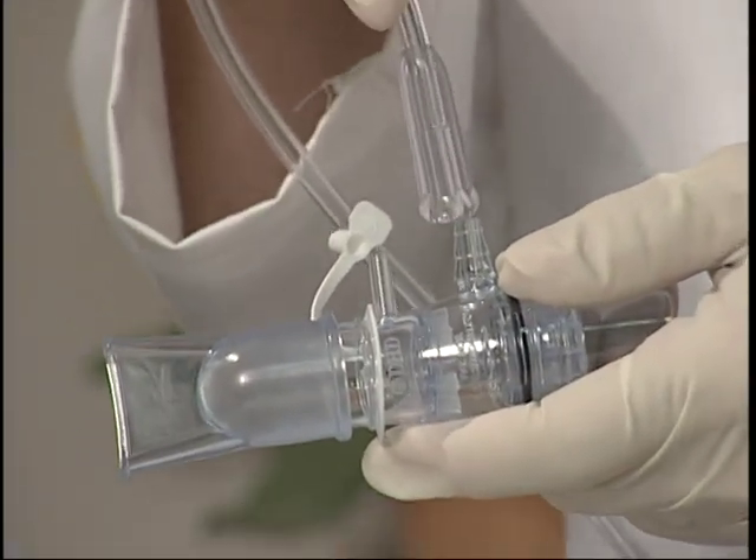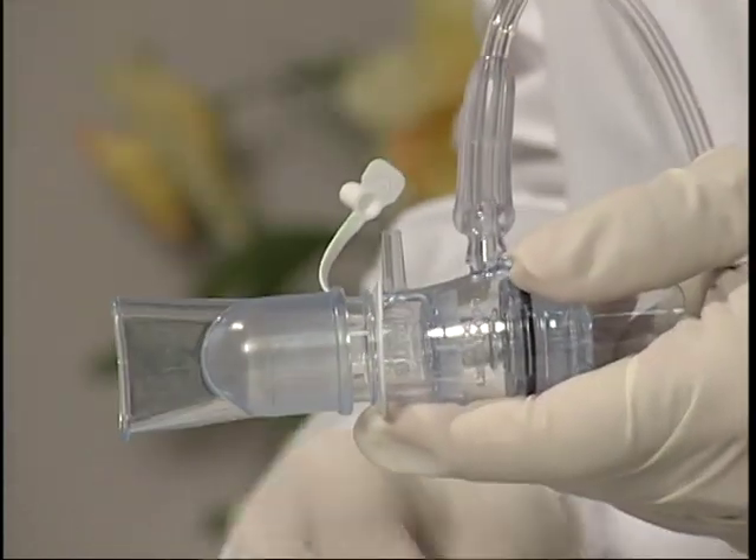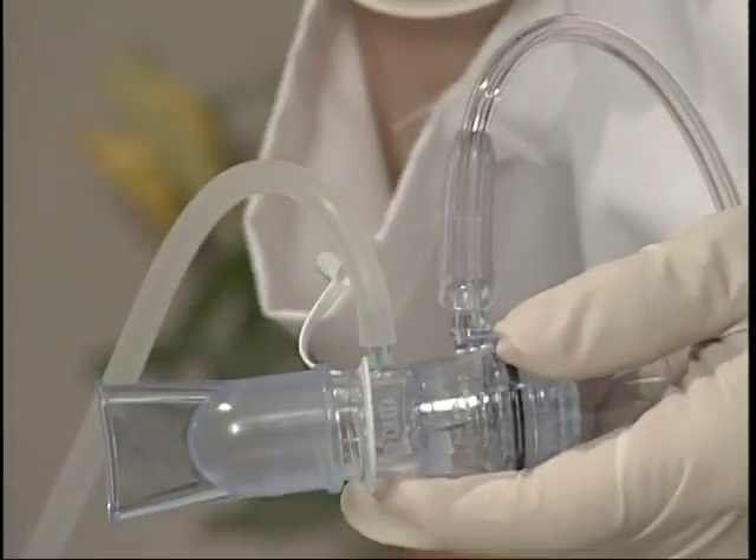Setup is easy. First, connect one end of the tubing supplied with the EZ-PAP to a 0 to 15 liter per minute flow meter connected to a 50 to 60 psi medical air or oxygen source. Next, connect the patient end of the tubing coming from the flow meter to the EZ-PAP gas inlet port. Then, connect tubing from the EZ-PAP pressure monitoring port to a pressure gauge.